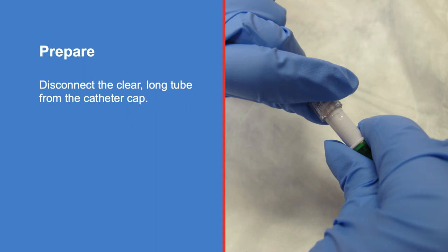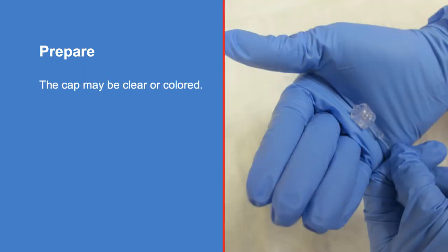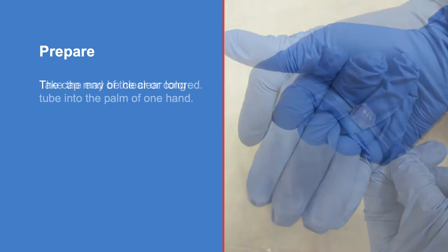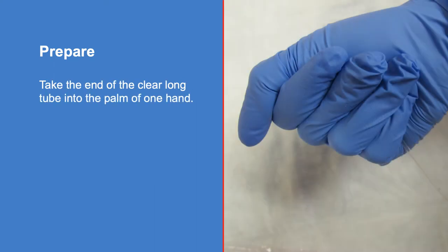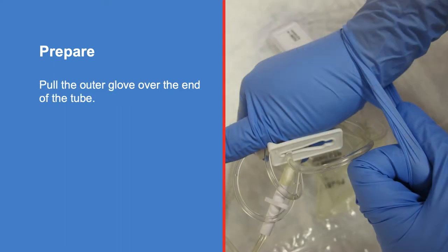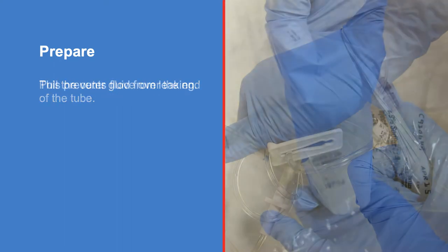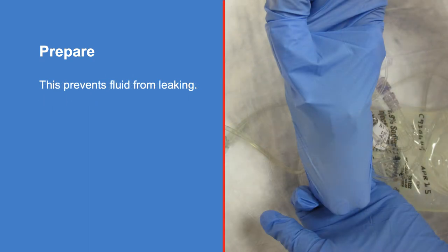Disconnect the clear long tube from the catheter cap. This line is connected to the used bag. The cap is connected to the needle in the port and may be clear or colored. Take the end of the clear long tube into the palm of one hand, then pull the outer glove over the end of the tube. This prevents fluid from leaking.